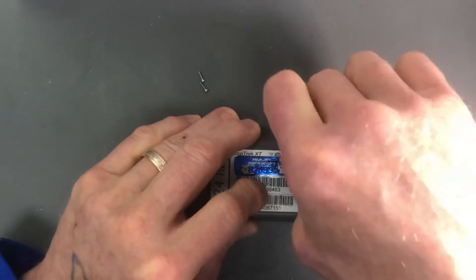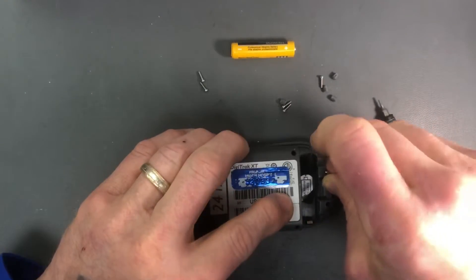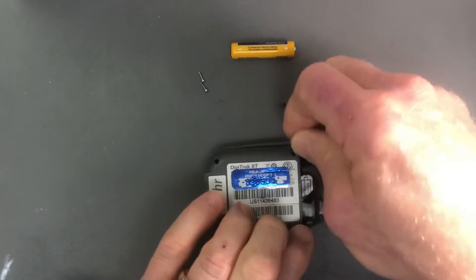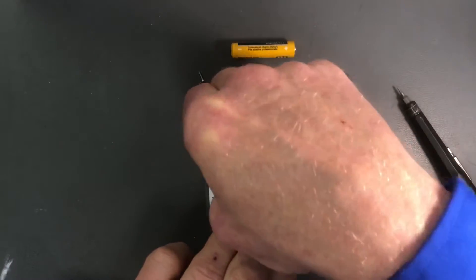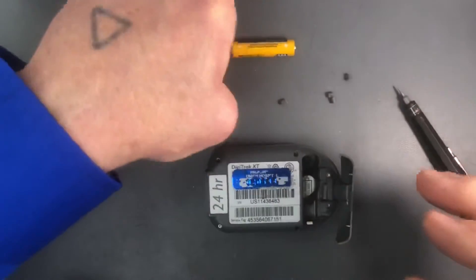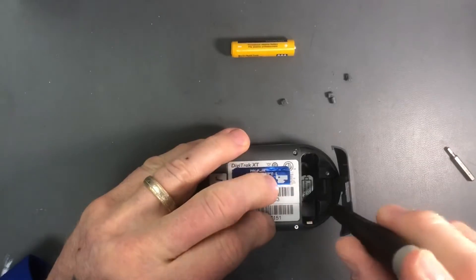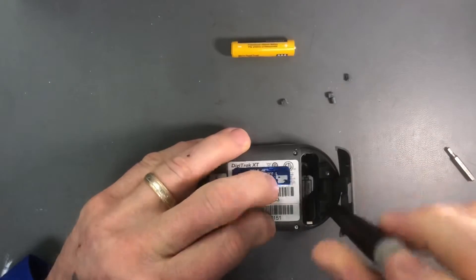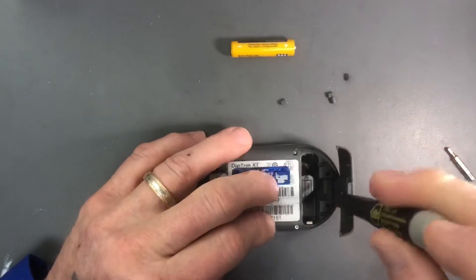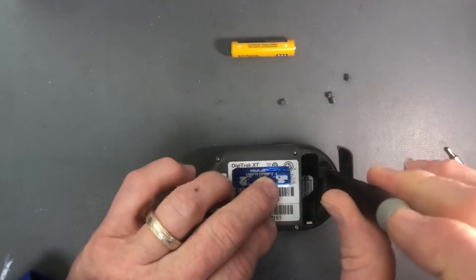At this point, pull the battery out. Take the screws and place them back in. Do not over-torque these screws — they're screws that are threaded into plastic, so just enough torque to keep things together and to make a seal.